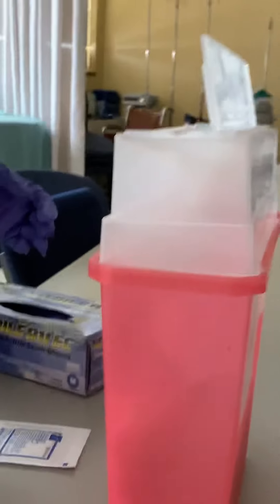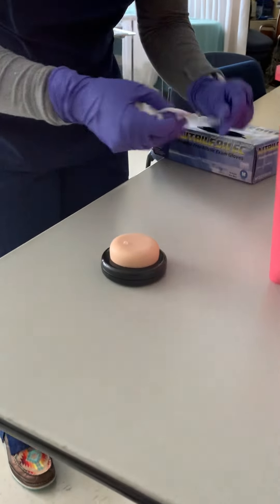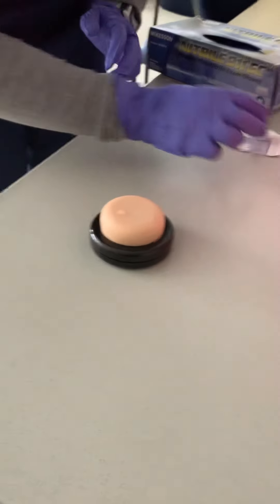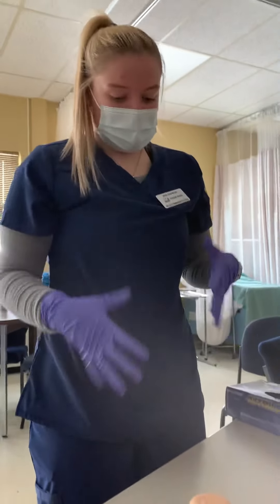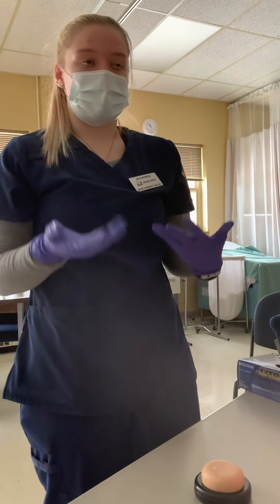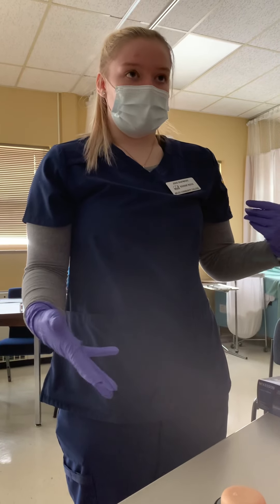I'll dispose of the needle in the sharps container and blot the area for any blood, then discard that. I will draw a one-inch circle around the wheal and explain to the patient that we performed a tuberculin test, so they'll need to come back in 48 hours to check for any reaction. Then I'll document what I did and where I did it.